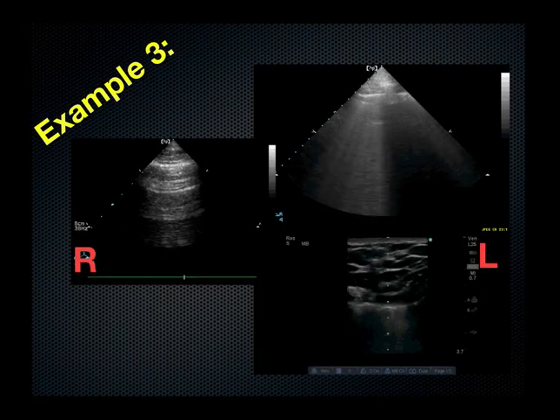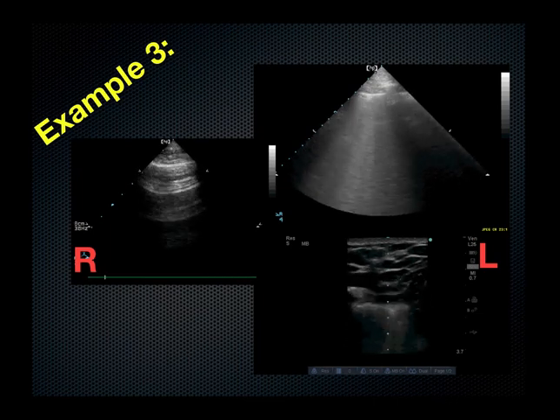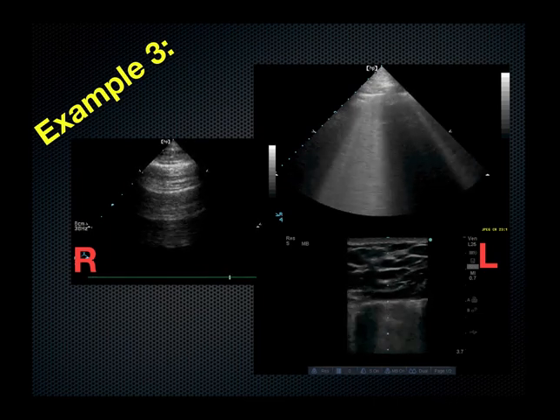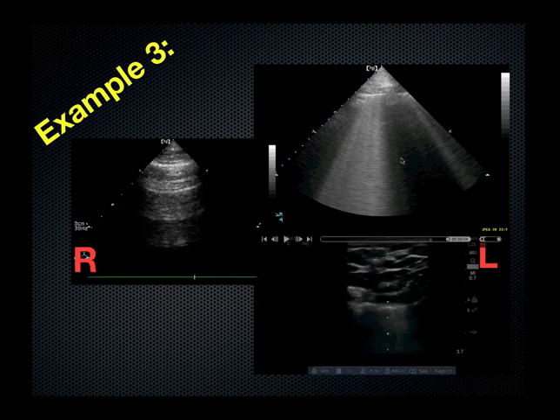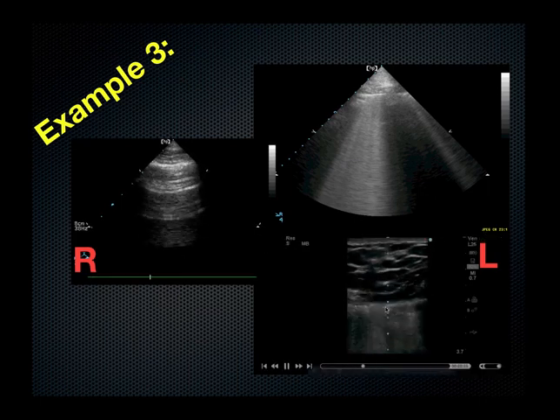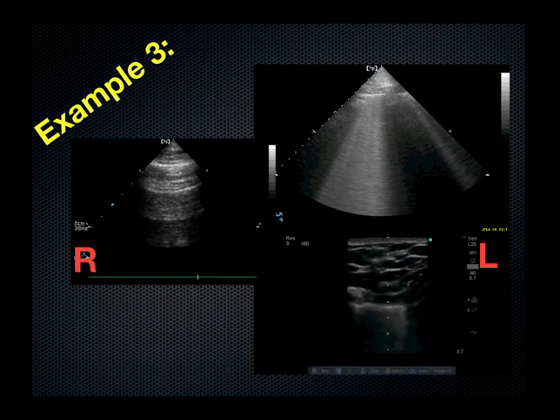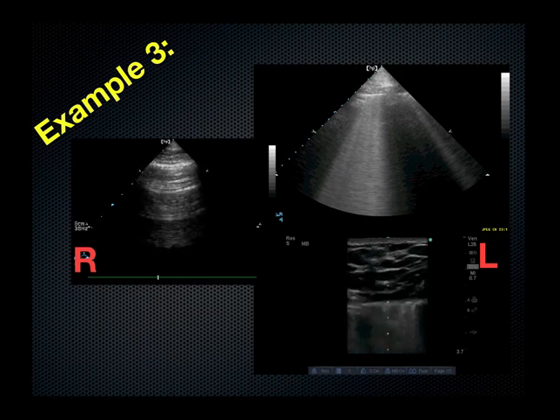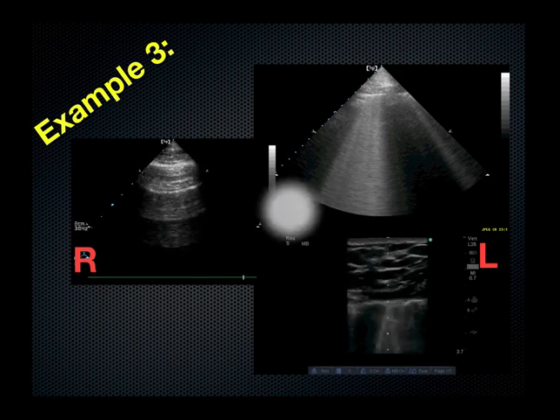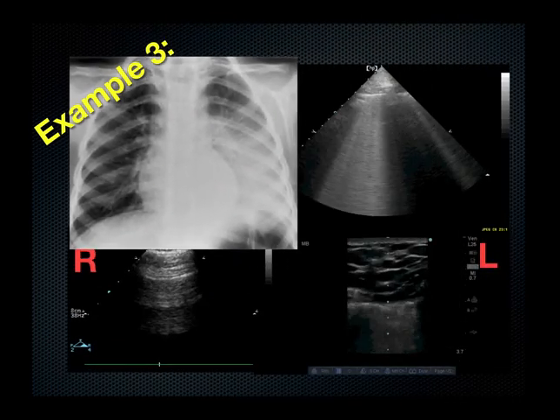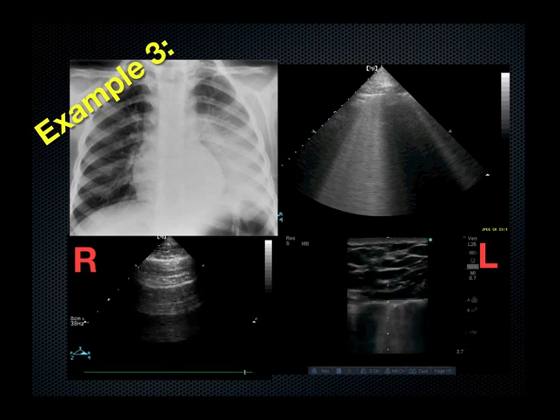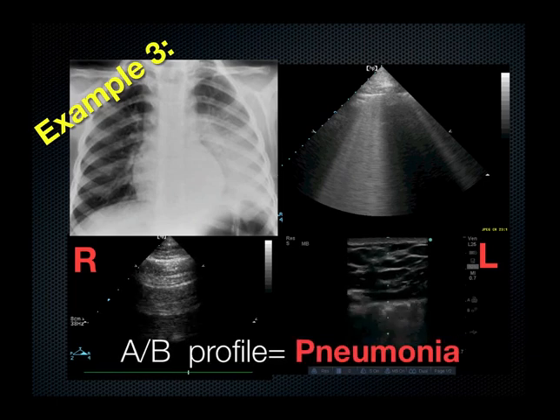Another example: patient arrives in the emergency room short of breath. Your ultrasound on the right has a predominance of A lines, while the ultrasound on the left has a B-line pattern all the way through. Even with a high-frequency probe looking at the pleural line, you can see multiple B lines originating from the pleural line indicating extravascular lung water in the interlobular septae. Chest x-ray might appear such as this — and you would be right to call this pneumonia.